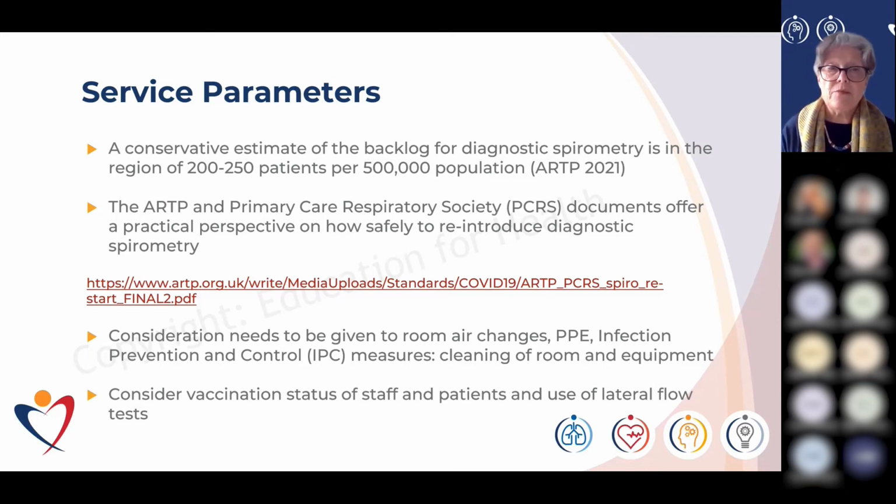The ARTP and Primary Care Respiratory Society document offers this practical perspective on how safely to reintroduce diagnostic spirometry, and that's the link there for those of you who haven't yet had the opportunity to find that document. It's got some incredible information in there, and that's what's being used to inform this webinar. Consideration needs to be given to room air changes.